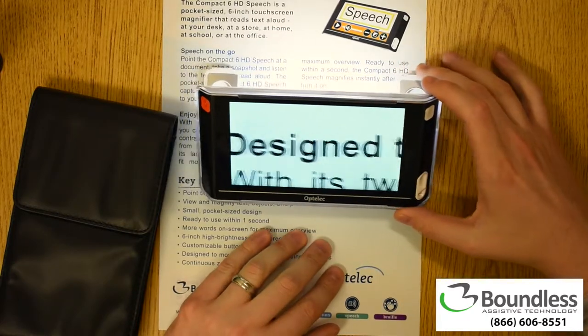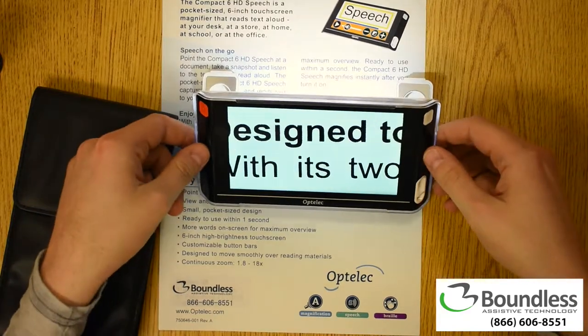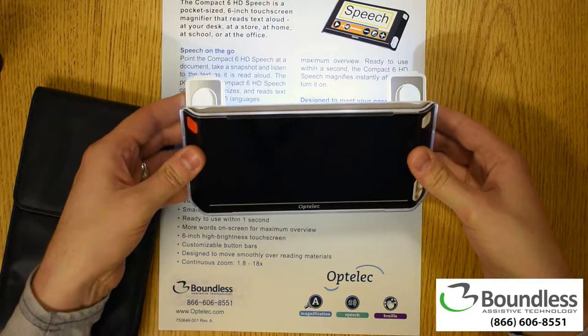This glides along quite nicely and it is definitely a light device. I'm going to go ahead and power it off for a brief second so I can show you the other side.